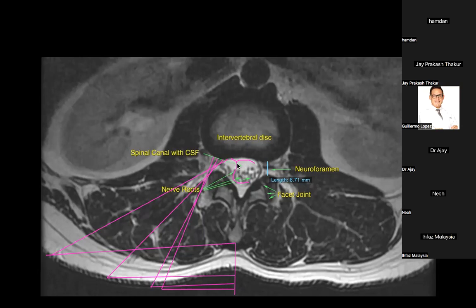At times this may happen, that the patient is having central herniation. It's not always necessary. Remember this. You must have seen in your clinical practice also. It's not always necessary that central herniation means central only. Usually the central one is like this, extending up to the lateral recess, or this one is extending to the foramen also. So it's a combination. Not always that you'll have only central herniation or only paracentral herniation. This may extend into the foramen also. Suppose they extend into the foramen. So again, what you'll do? You'll go to the foramen and start clearing it from there.